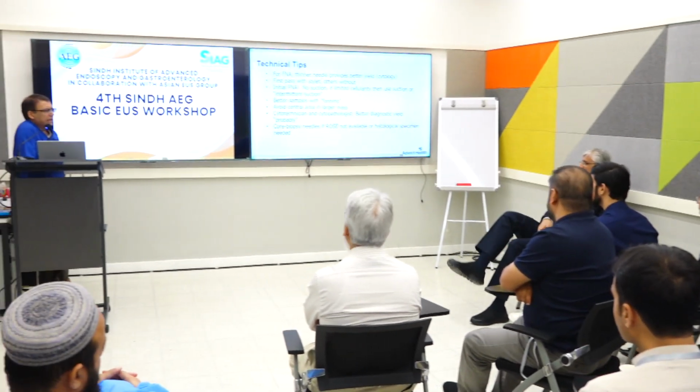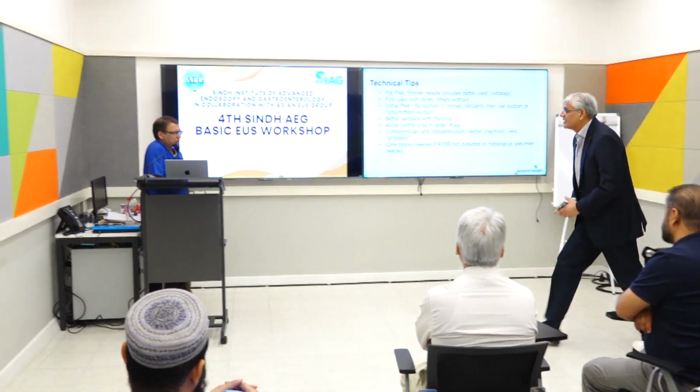So even with the FNB needle, we have a good tissue specimen.